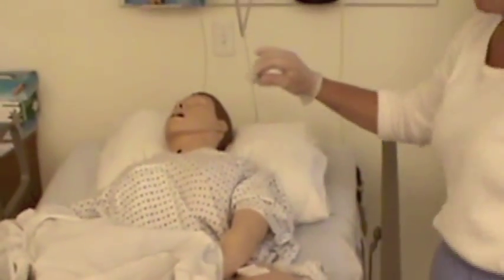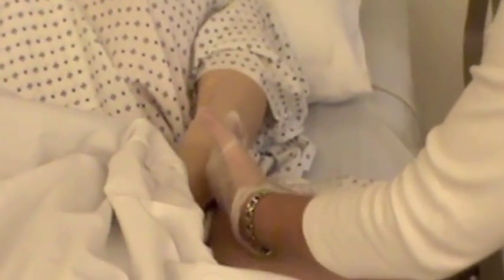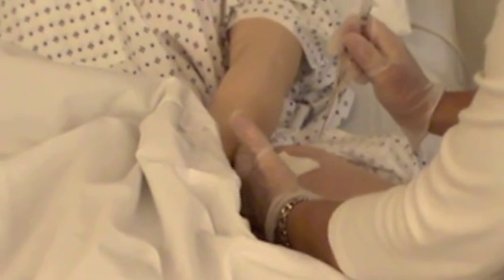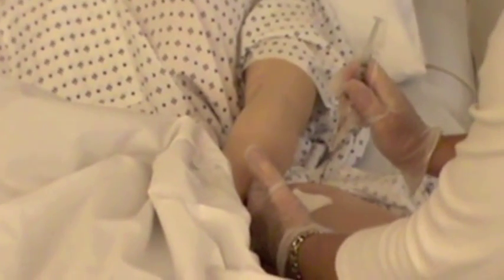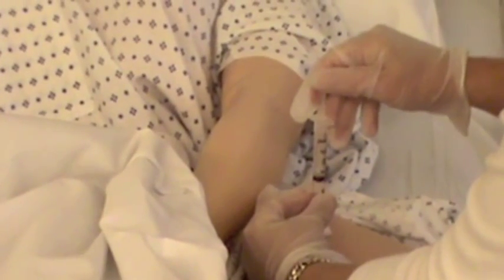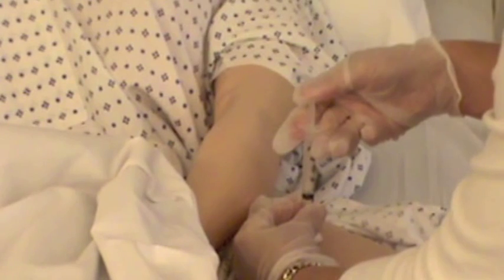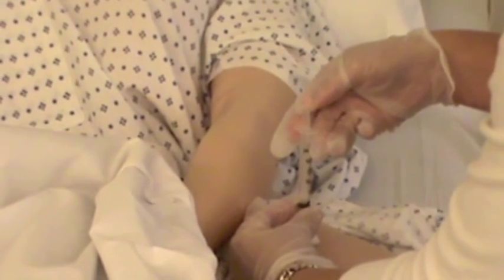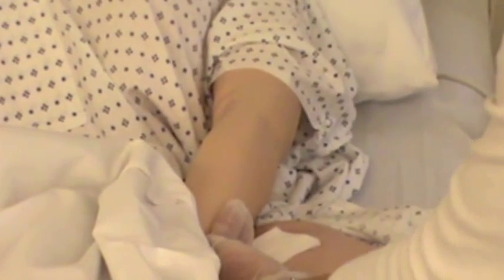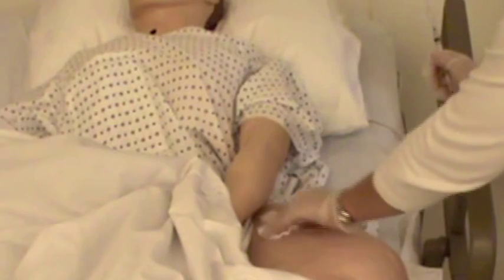I'm going to pull off the cap and throw it away. I'm going to use Z-track, so I'm going to pull the skin to the side with the outer aspect of my hand. Okay, you're going to feel a pinch now, Mr. Ito. 90-degree dart-like angle. Okay, stabilize it with my left hand. Aspirate. 1, 2, 3, 4, 5. I didn't receive blood, so I'm going to inject at a rate of 10 seconds per mL. Okay, and then I'm going to move my hand out of the way, take the needle out, and release his skin, activate the safety, and cover the site.